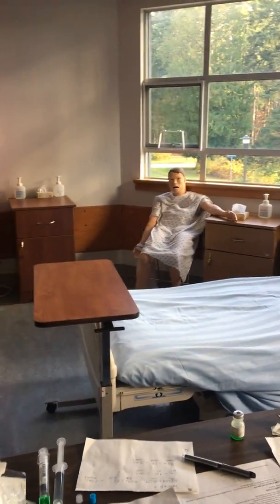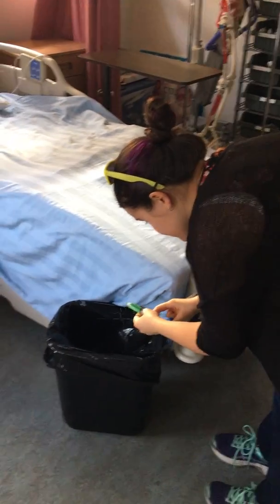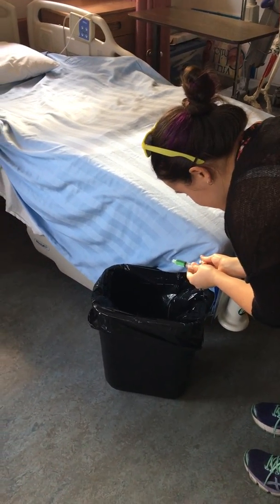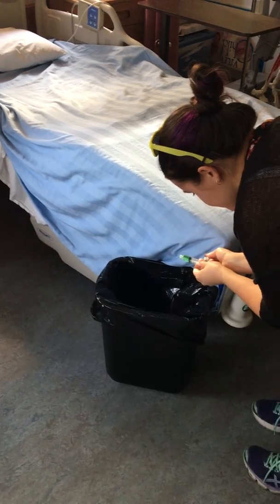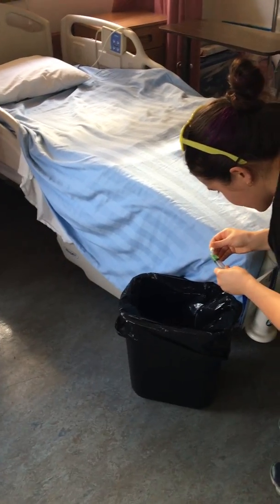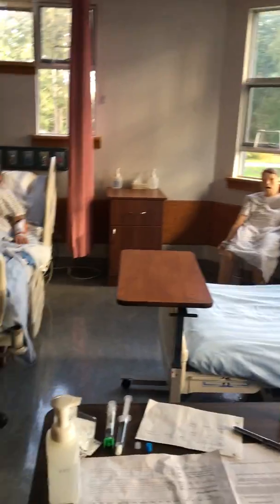And I'm going to waste some into the appropriate container using a no-touch technique on my cap. There, now I'm going to have another nurse sign the wastage. And now I have 2.5, which is what I'm going to administer to my client.